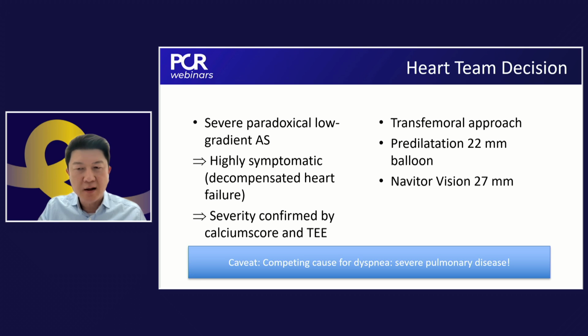Becky and Philipp, another question? Yeah, go ahead. If there's a degeneration of the prosthesis, which kind of valve would you be thinking of for revalving in this case? Yes, I would choose a Sapien, probably a balloon expandable platform. Because of the coronary uptake or the sinus?